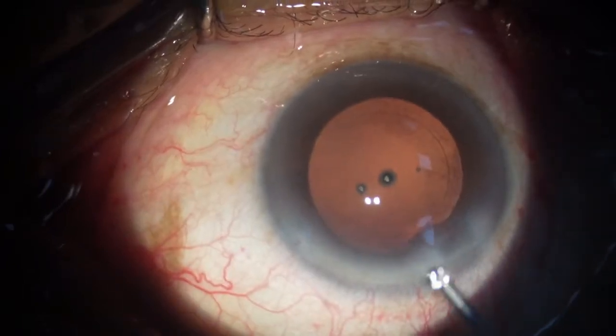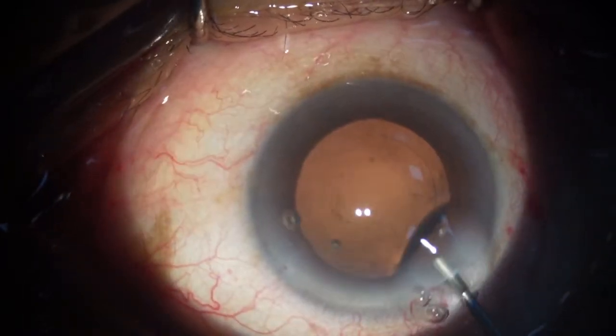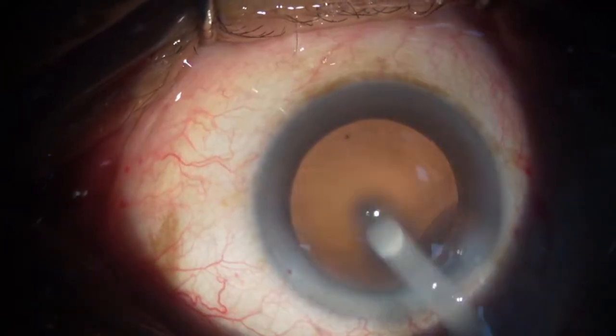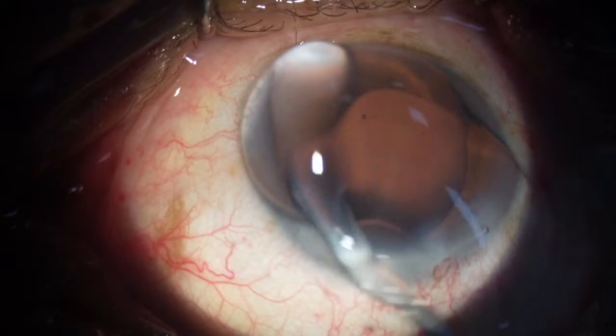Putting in viscoelastic, and I'm now ready for the lens injection. So inflating the bag here, putting some visco on the cornea.